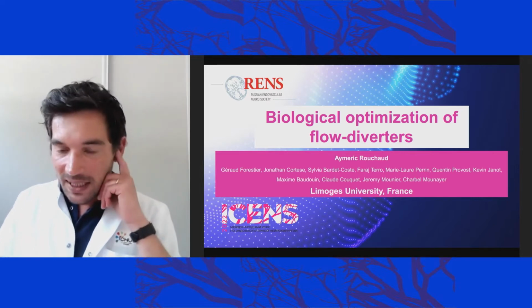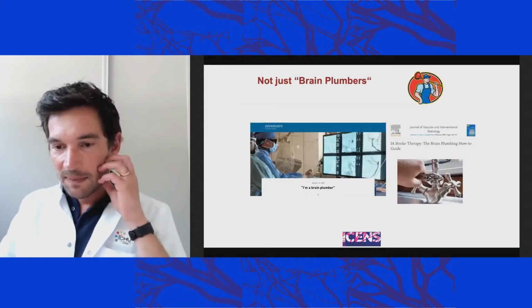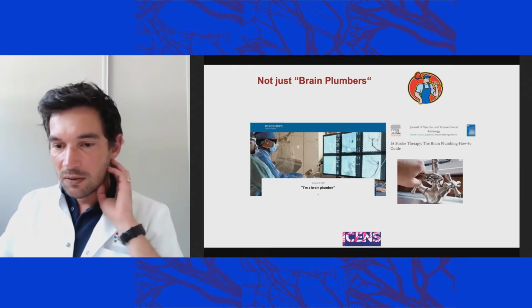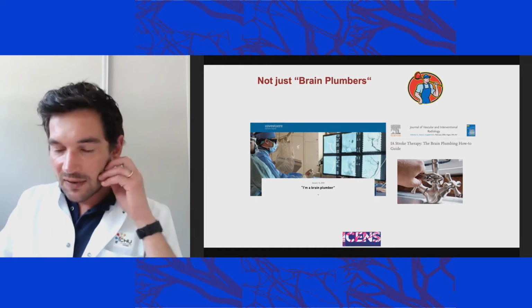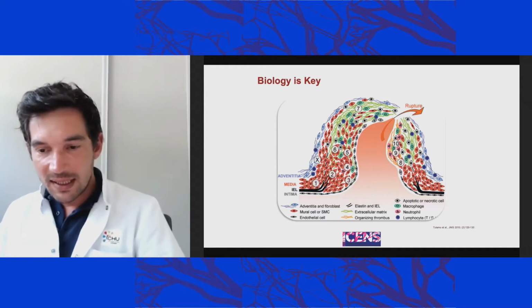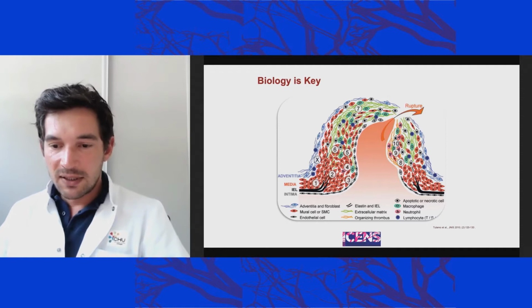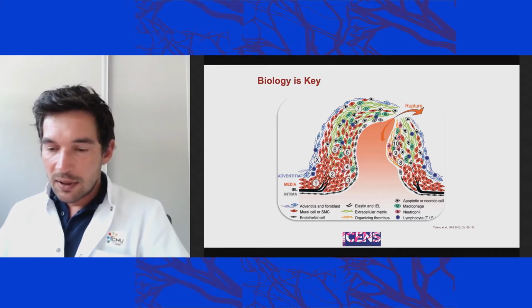So my talk is about biological optimizations for flow diverters, and we should remind ourselves that we are not just brain plumbers. When we present ourselves in our profession, we often say, I'm the plumber of the brain. But first of all, when we have an aneurysm, it's because there is a biological disease, and this disease leads to rupture in some cases.